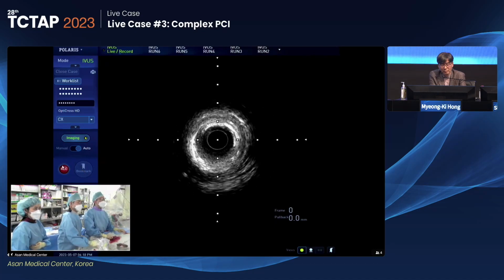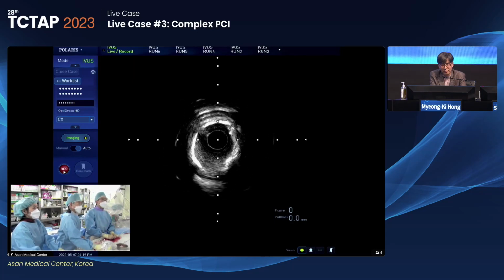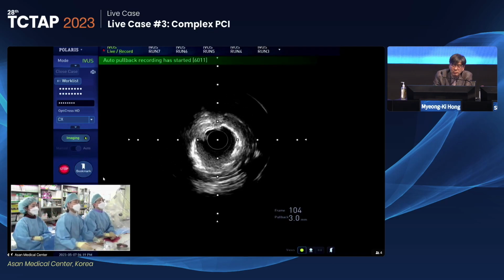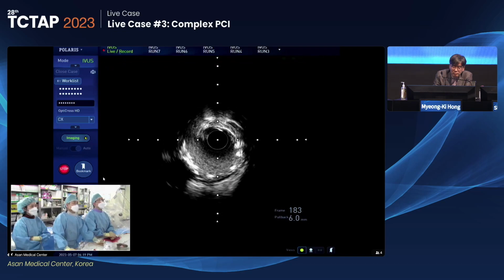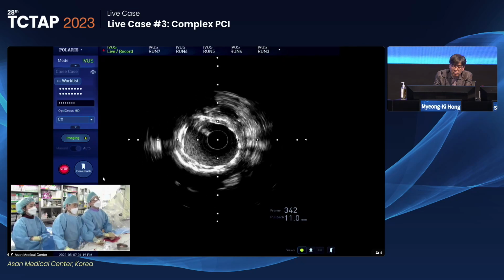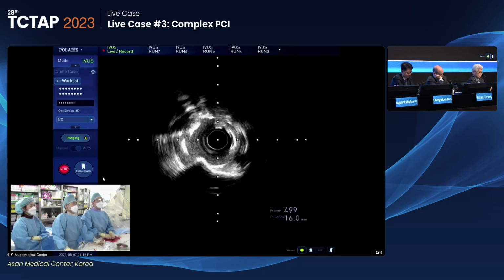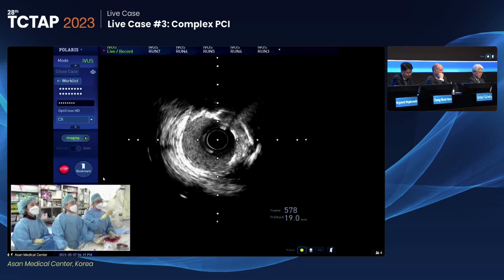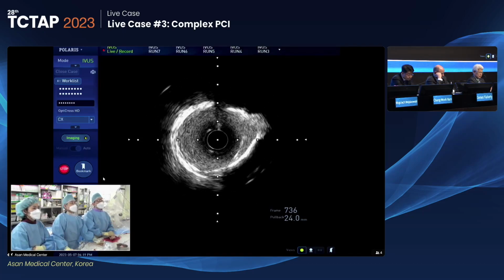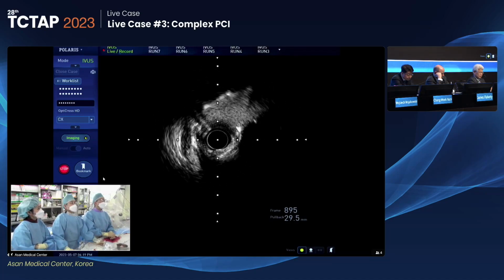Yeah, this is the previous very tight lesion. Okay, further. Pullback, distal edge. I think the scan is placed at the calcification. Not a very good position, but I think it will be acceptable. Here is the previous tightest lesion, and you can see the under-expansion and malposition of the stent because of calcification, and that's why calcification makes a worse outcome.